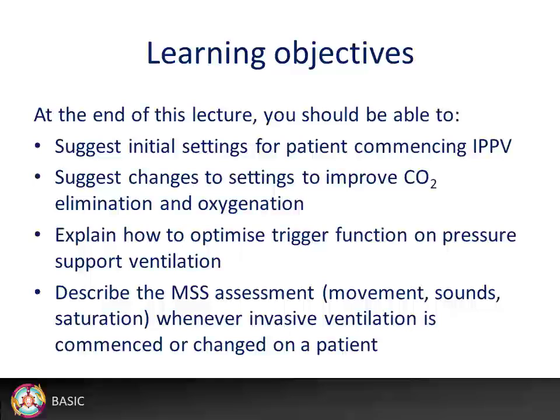At the end of this lecture, you should be able to suggest the initial settings for patients commencing mechanical ventilation, suggest changes to improve carbon dioxide elimination and oxygenation, explain how to optimize trigger function on pressure support ventilation, and describe the MSS assessment, movement, sound, saturation, whenever invasive ventilation is commenced or changed on a patient.